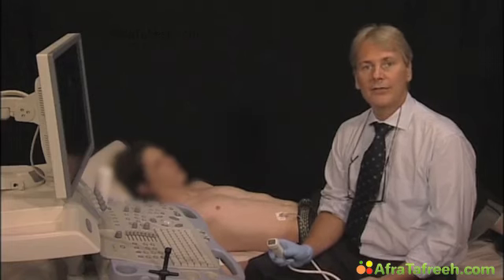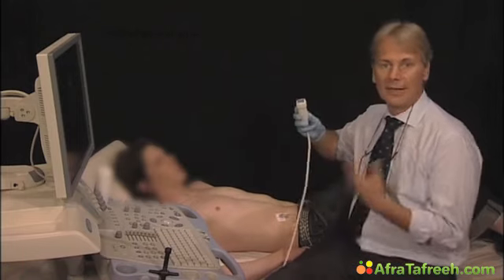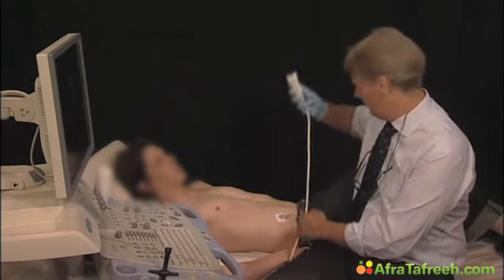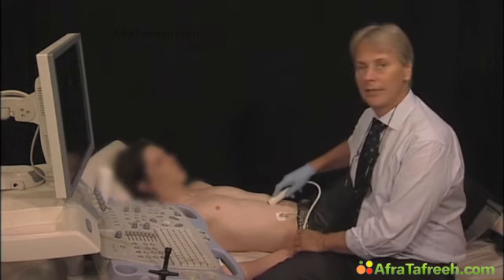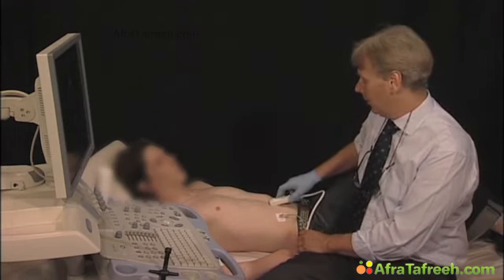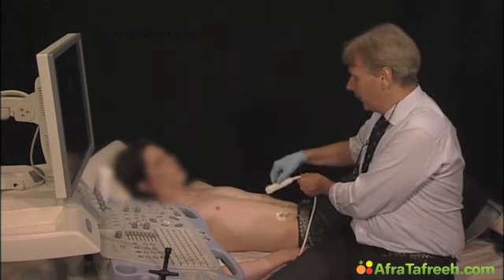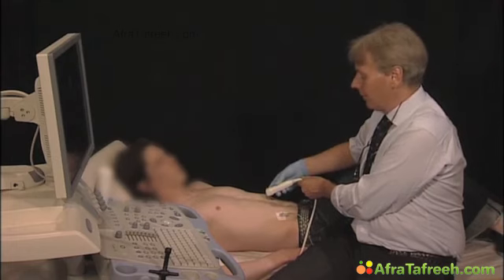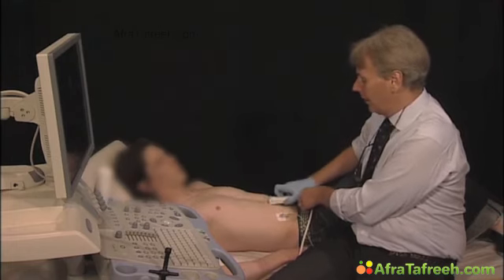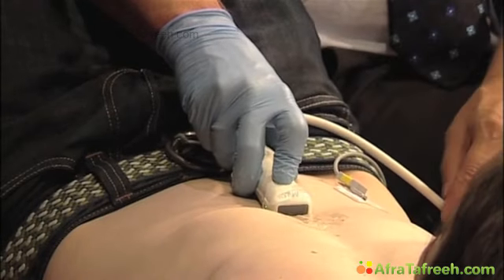To achieve the subcostal views, the patient has to be lying on his back, and it's advisable to also have the patient bend his legs so that the abdomen is relaxed. Now, when you hold the transducer, I would recommend that you hold it in such a way that you only touch the transducer on its sides and not below, because that way you can get much more shallow towards the abdomen, which you often have to do.